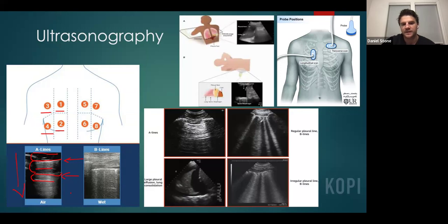Here's a couple quick examples of pathology. Over on the right, we can see some B lines, which are vertical lines. And this is basically what happens when the ultrasound hits fluid. You can see some of the lines actually project downward. And that's just basically a pocket of fluid that the ultrasound is able to capture and doesn't necessarily get reflected against. And so it's actually reading the return of the ultrasound when it hits that, and it creates a shadow effect.